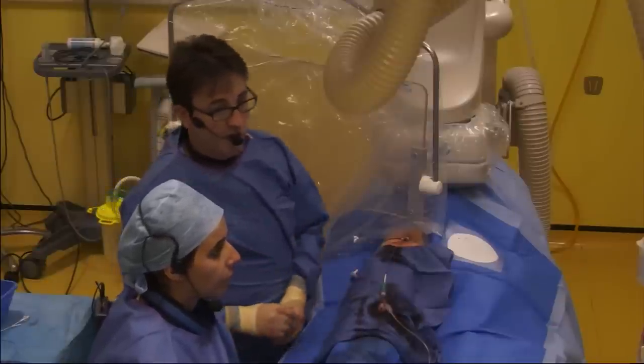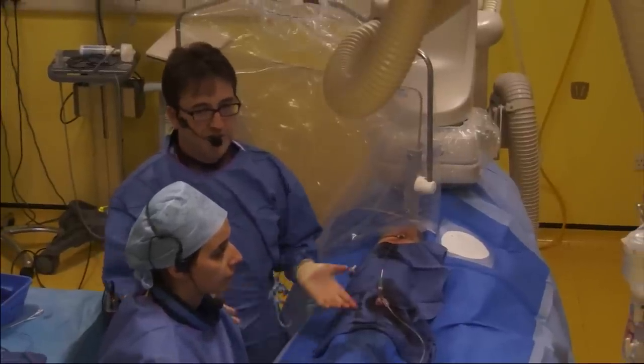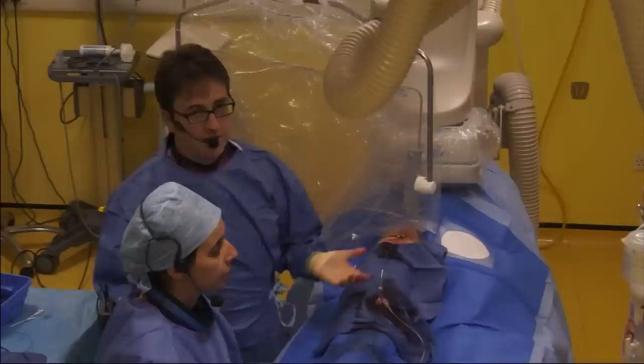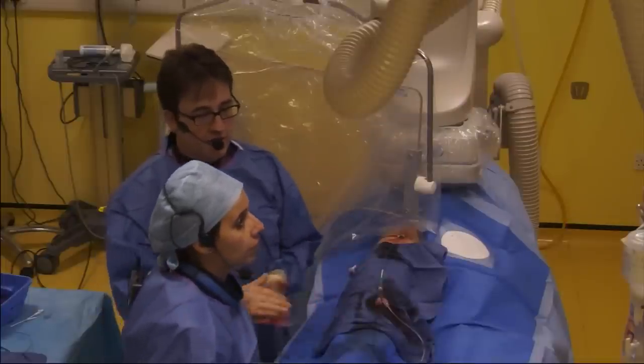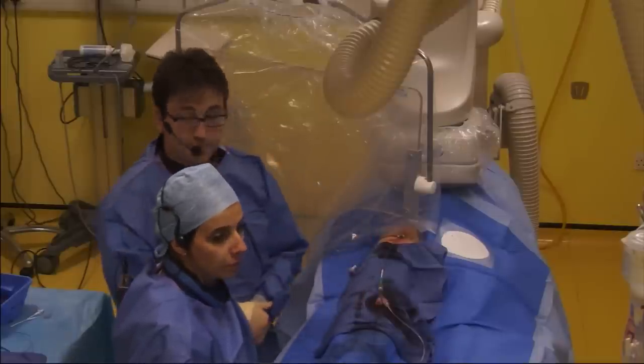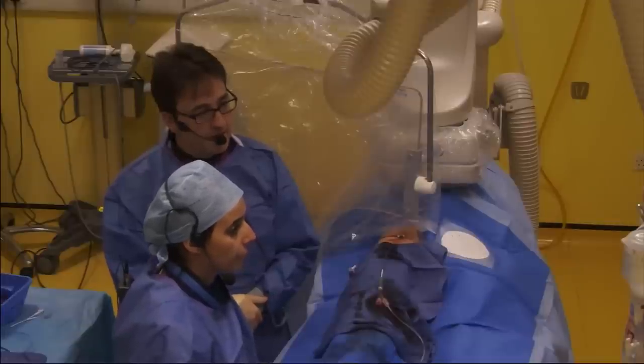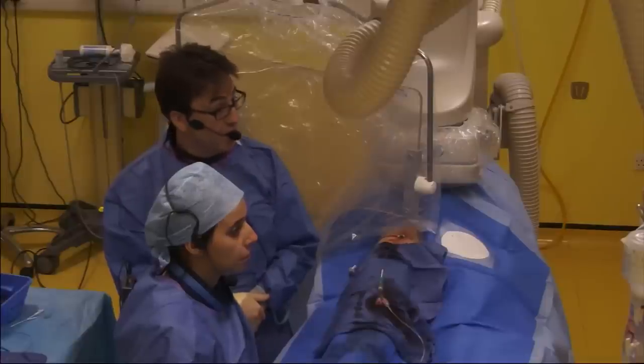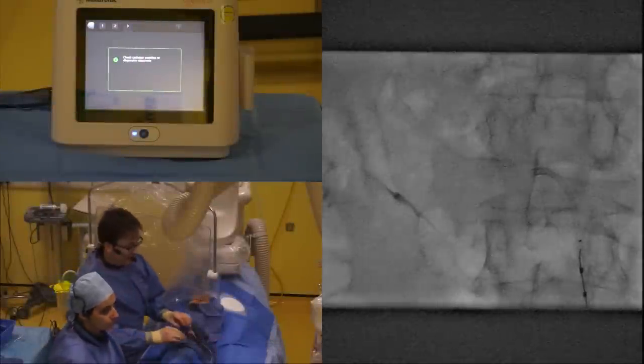Whatever we do, we're probably misshaping the spiral slightly by withdrawing it back into the catheter. So, we'll have a look at that when we go to the left side and see if that makes any difference. This is a learning point, and most of us who have done this have done only a handful of cases in humans, and most of them have been done in animals. Animals have got very straight, healthy arteries, but they're all young, healthy animals. So, it's a very different experience. Even if the problem is interaction with electrode four with the guiding catheter, you don't have all four in. That'll provide such stability, you can back your guiding catheter right out.